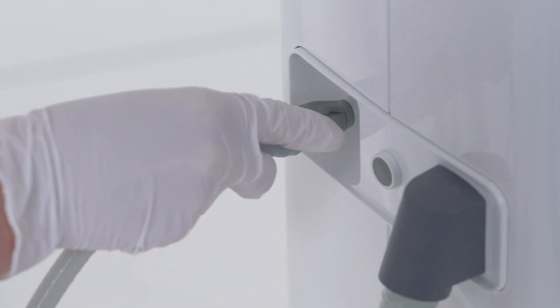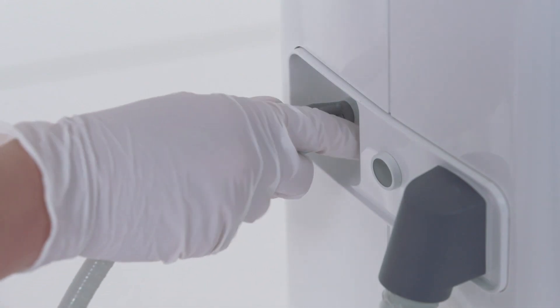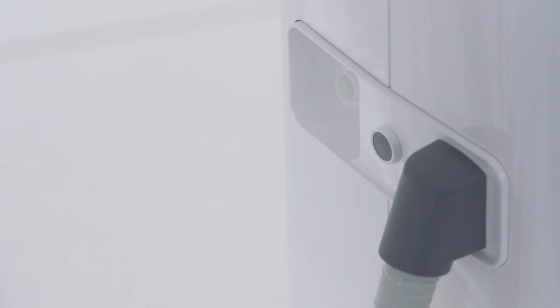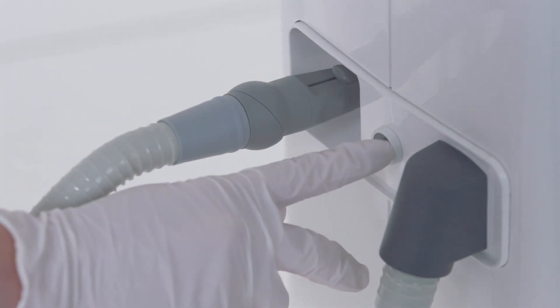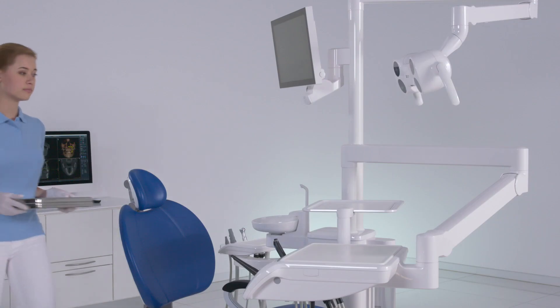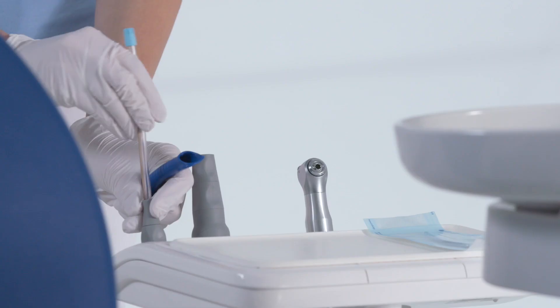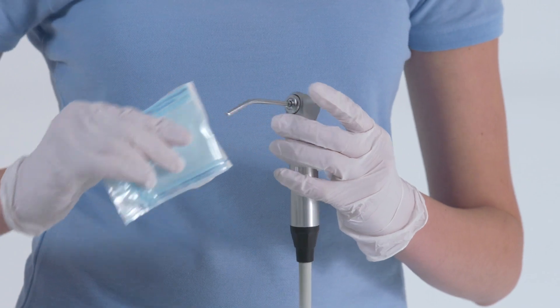Perform suction hose cleaning. Place the suction hoses in the adapter in the water unit one after the other and press the grey button to start the function. Prepare your treatment center for the day ahead and configure the dentist and assistant elements with the instruments required for the next treatment.